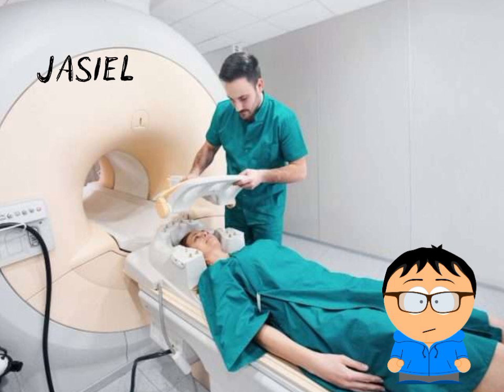3. Control console, which allows the operator to adjust the scan parameters and coordinate the equipment's functions. 4. Computer, which processes the received signals and transforms the data into images that radiologists can interpret. 5. Examination table, where the patient is positioned during the scan. The table can move in and out of the magnet. 6.